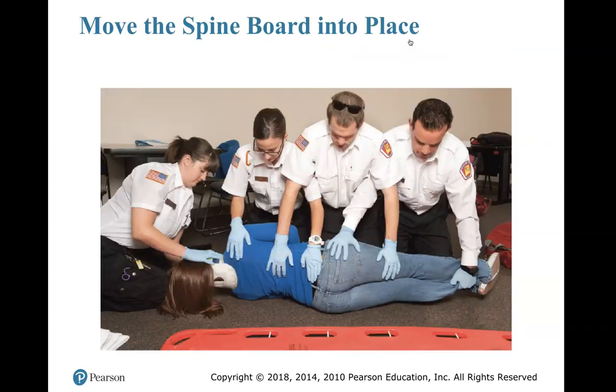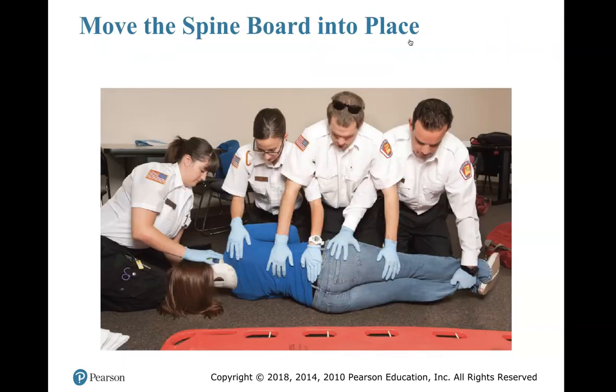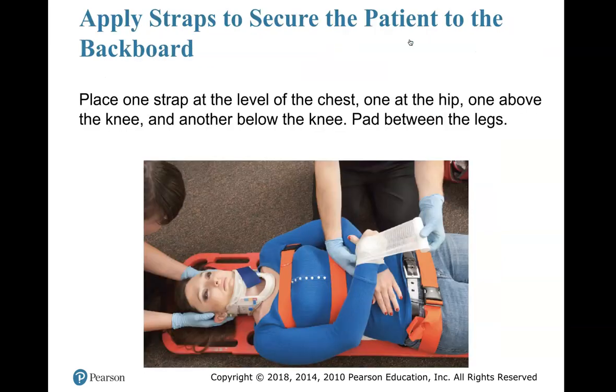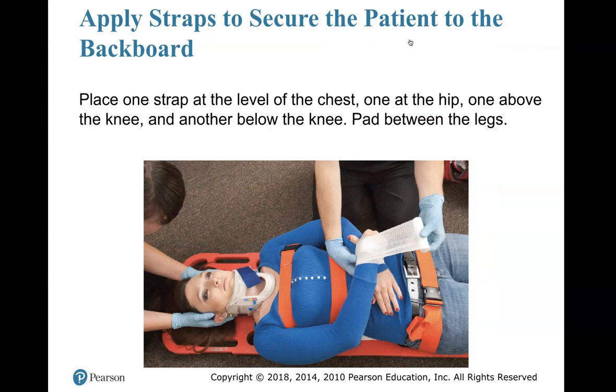Patients roll to their side. The backboard is placed underneath the patient here. They'll slide that backboard underneath the patient, and then they will log roll her back down on the board. And I will tell you this, that whenever you log roll your patient back down on that board, they are not going to be perfectly centered on the board exactly where you need them. So in between this step and this step, you will have to do a technique where you move the patient up and down, their whole body up and down the board until they are on the board to where you need them. And I will show you that in class.